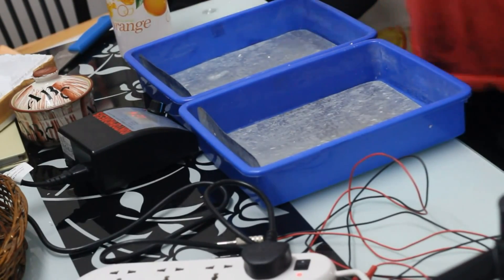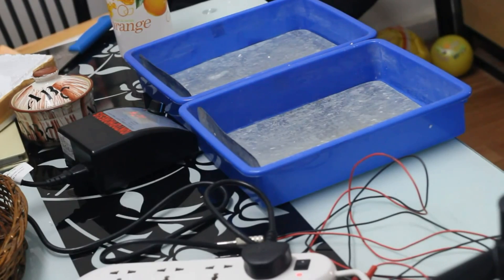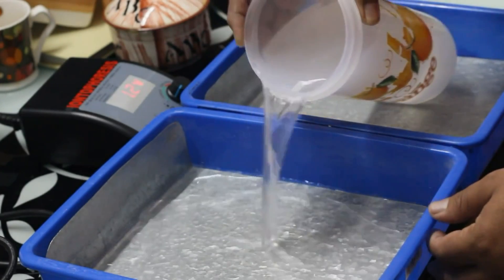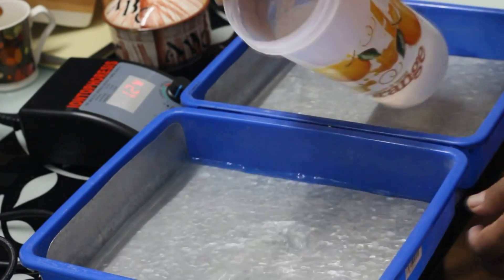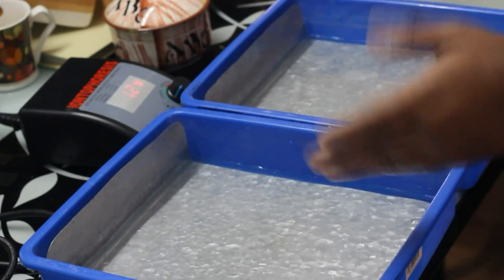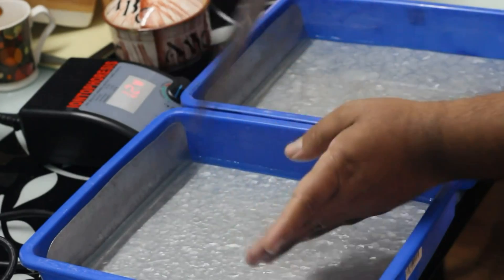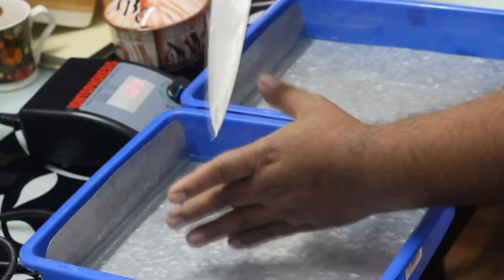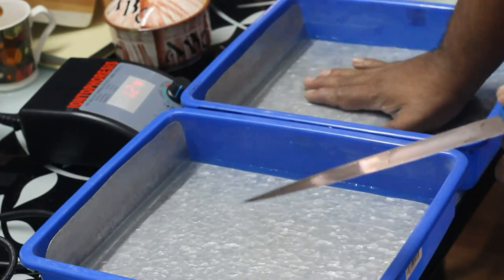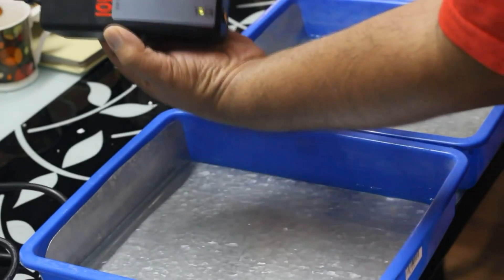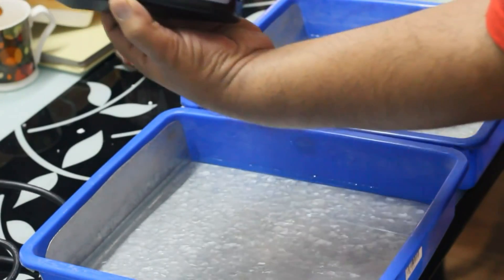There is a minor sort of electricity that will be passing through your sweat pores. Once this passes through your sweat pores, your sweat glands will get shrink and blocked. Thus, in 45 days, your palms or feet which are sweating will completely get dry. Now, I'm pouring the water level. It is understood that you should not cross the water up to the wrist level. There is a white indication on the skin. You should not extend to the darker area of the skin. The palms area which is white, you can put the water up to where sweat is coming, which will cover your fingers a little, not more, not up to the wrist.